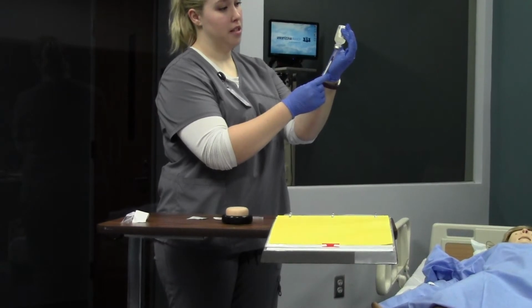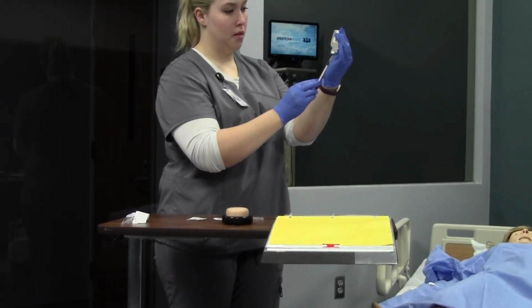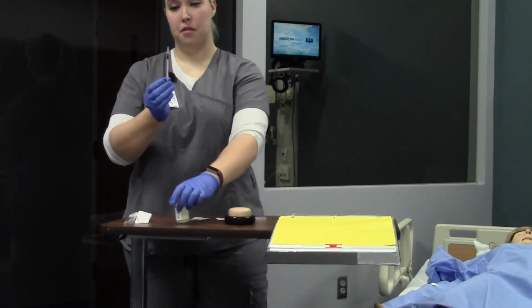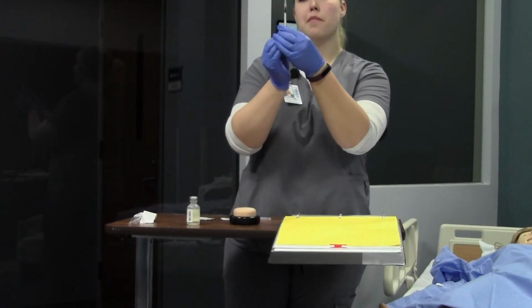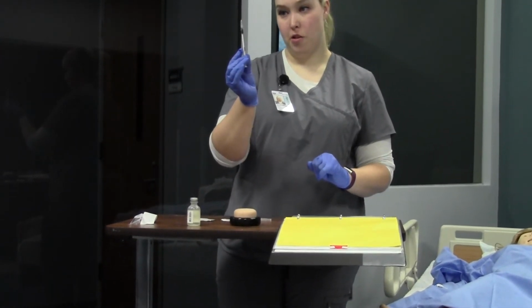Just a little bit past. I have a pretty decent sized air bubble, so I'm going to inject that back, pull it out, and tap to make sure I have no air bubbles and it's the correct dose. Again, checking my MAR, make sure it's the correct dose.